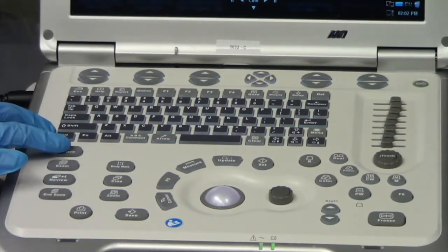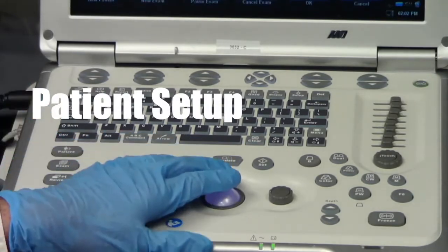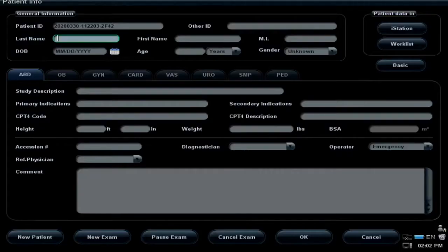So we're going to start here with the patient button. And for this exam, the last name is going to be liver. And because this was set up as part of gastrointestinal and metabolism, GI and M, we're going to label this as MD 105 for the first name.